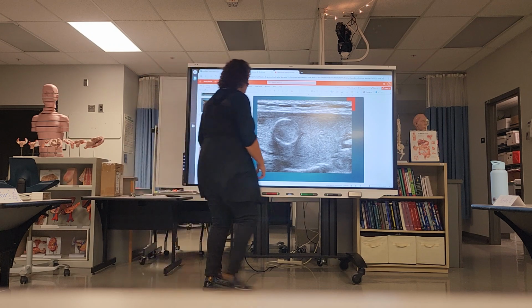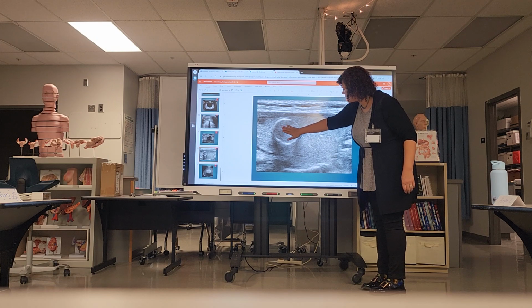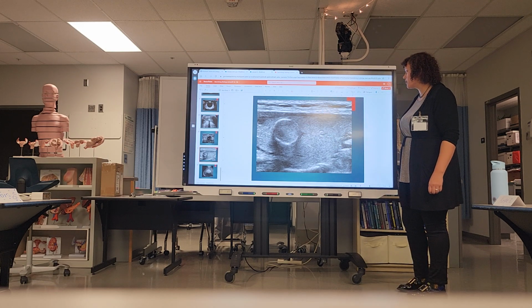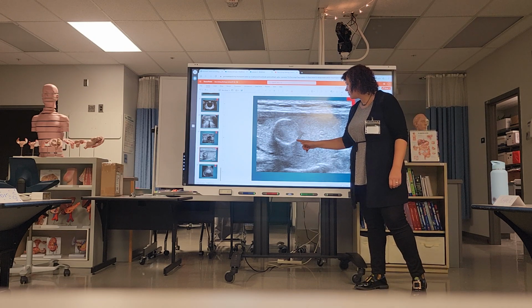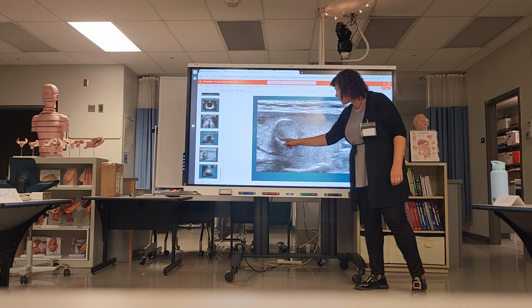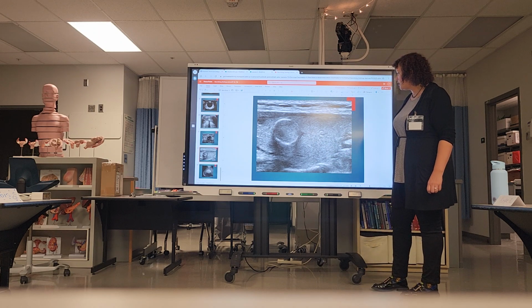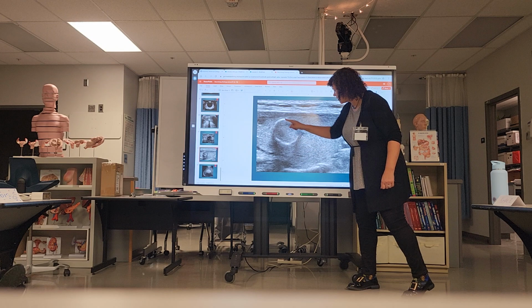All right. How would you define this structure here? So just this tissue inside of the structure. Isoechoic. Isoechoic, yeah, for sure. What about this border? Well defined, absolutely. We have this posterior rim. This is called eggshell calcification. Is it solid or is it cystic? Solid, yeah. How do we know? No enhancement, yeah. And we have this edge shadowing here.